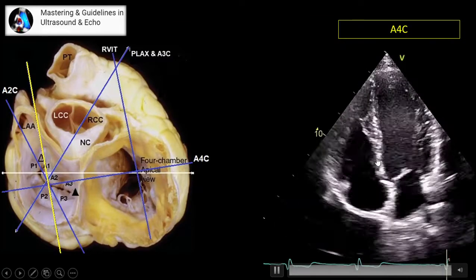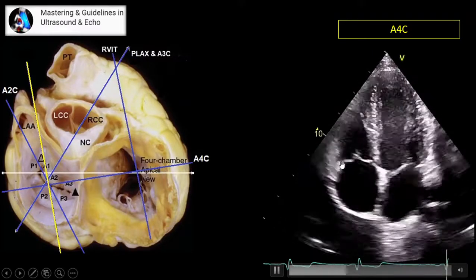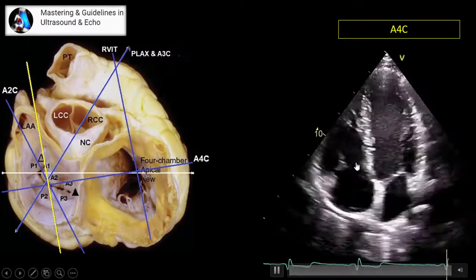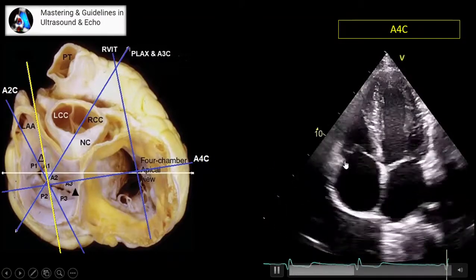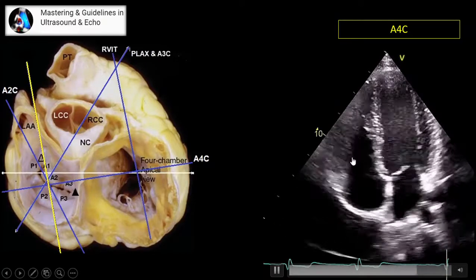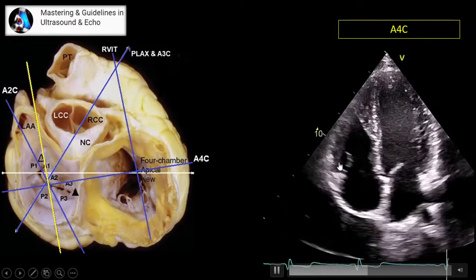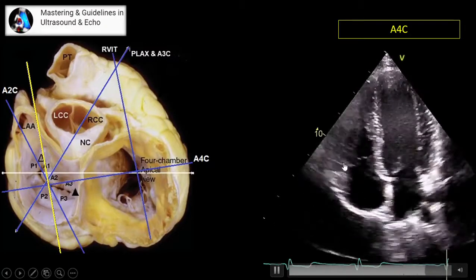The one toward the septum is septal, and the lateral one usually is anterior, but it can be the posterior tricuspid valve leaflet too. Shortly I am going to explain why it can be the anterior or posterior tricuspid valve leaflet.